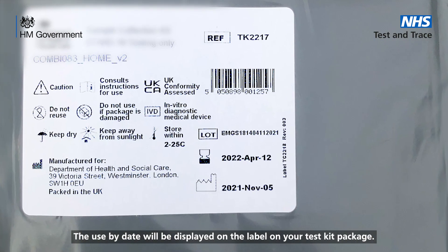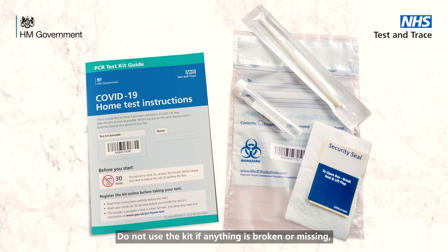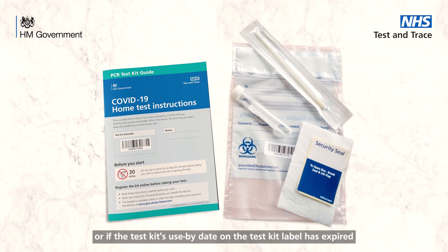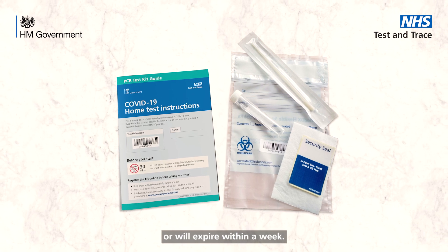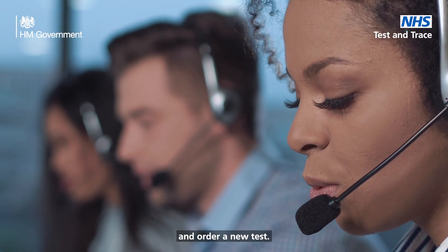Check the use by date and make sure the test is still in date. The use by date will be displayed on the label on your test kit package. Do not use the kit if anything is broken or missing, any barcodes do not match, or if the test kit's use by date has expired or will expire within a week. Contact the call centre on 119 and order a new test.